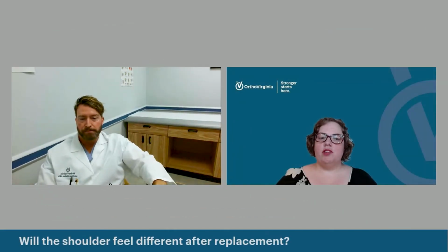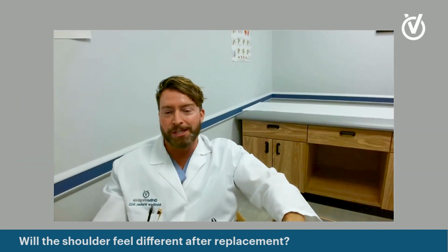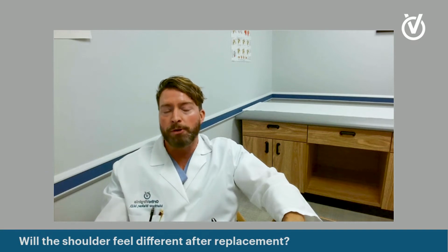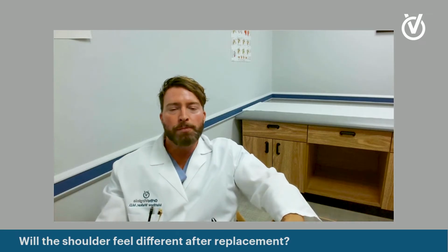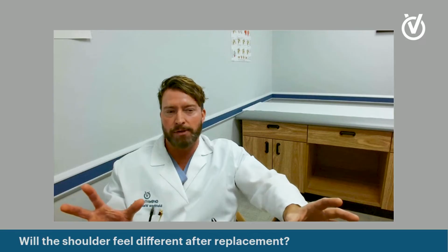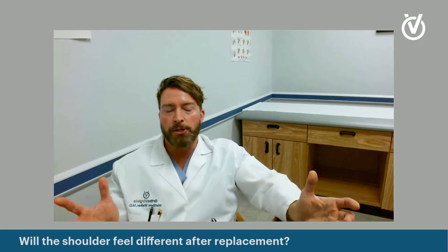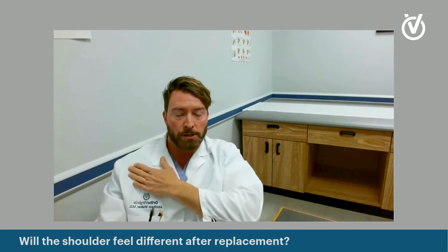Thank you. Will the shoulder feel different after replacement? It will feel different. Hopefully it'll feel better. Again, the number one reason to do this is pain relief. An anatomic replacement in general will feel more like your shoulder did before you had arthritis. The reverse replacement comes in various different designs. Every company has a slightly different geometric design to these. And so from a physical standpoint, the reverse replacement may look different.